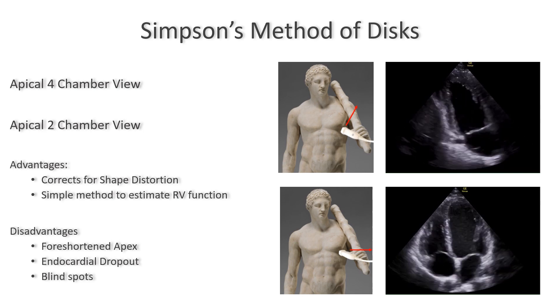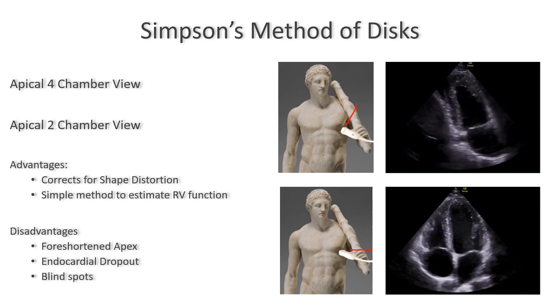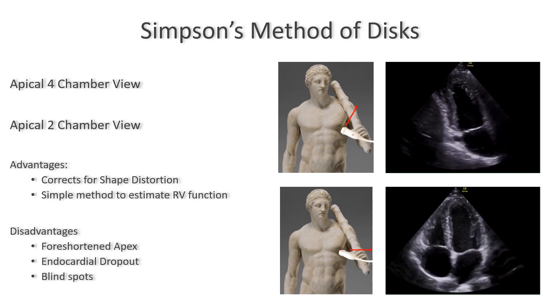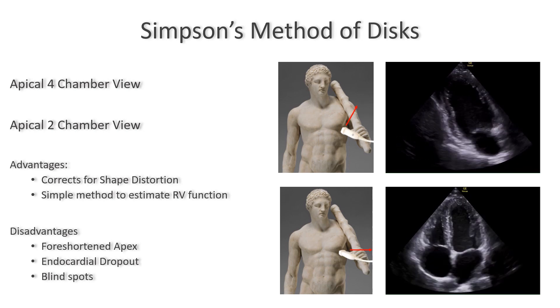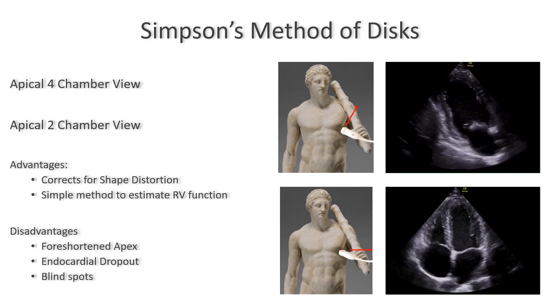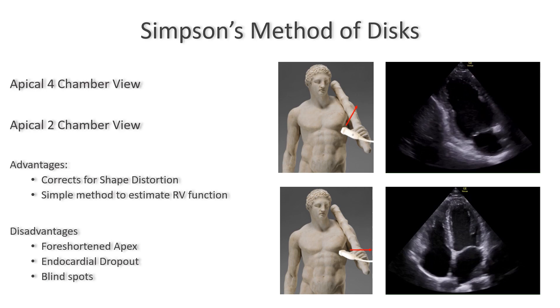Since we are calculating the left ventricular volume from only two views, if there are shape distortions in other areas, they will not be included in the measurements.